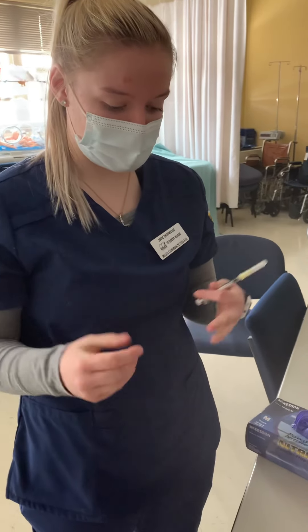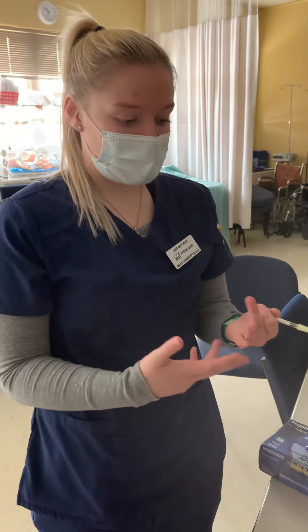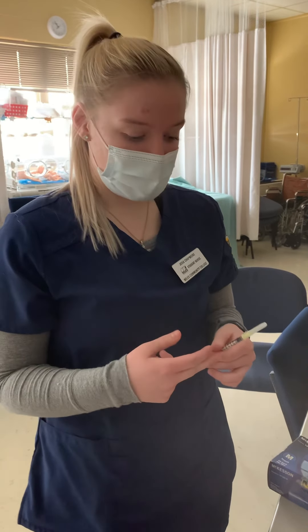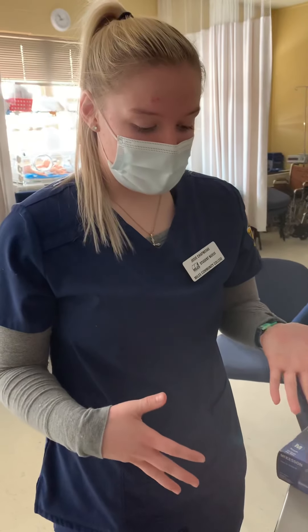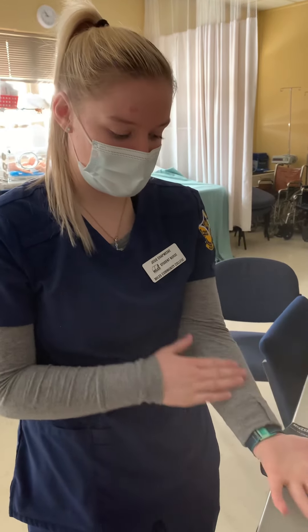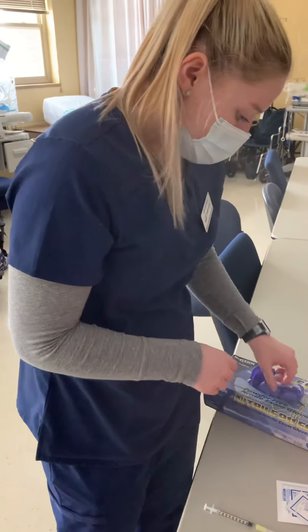I will identify my patient using two patient identifiers: name and date of birth. I'll double-check my patient's allergies, the medication, the dose, the route, and the time. Then I'll explain to them what I'm doing — I'm going to be giving a tuberculin shot today, intradermally on the inside of their forearm.